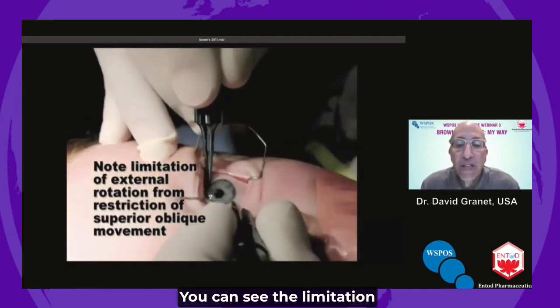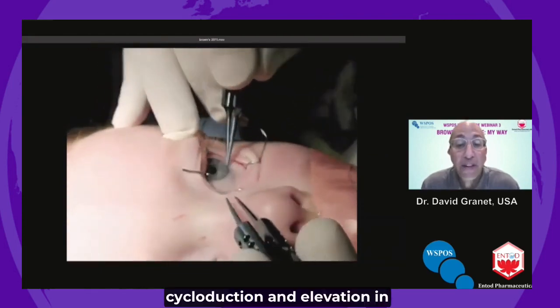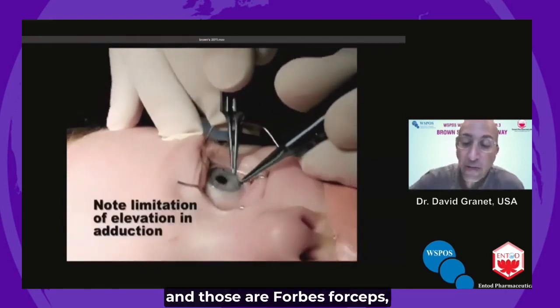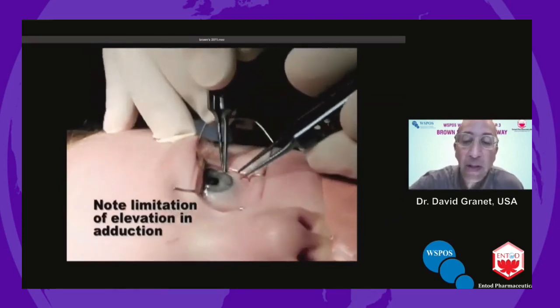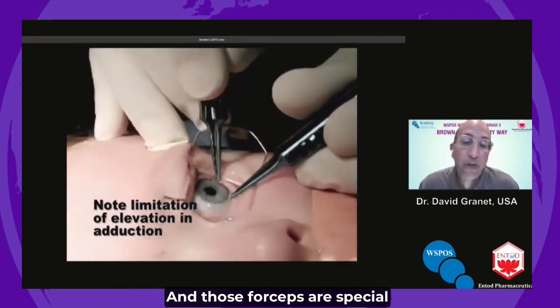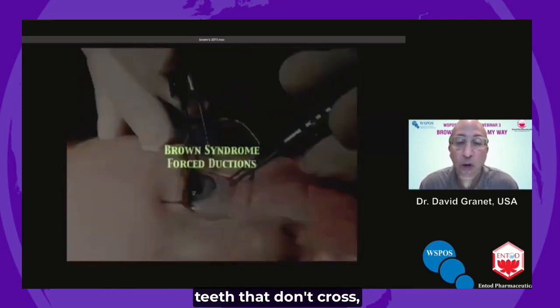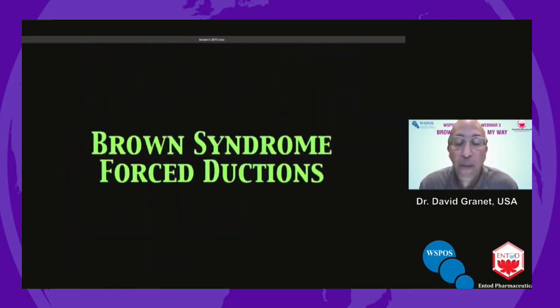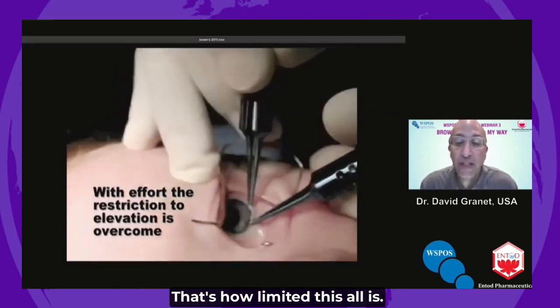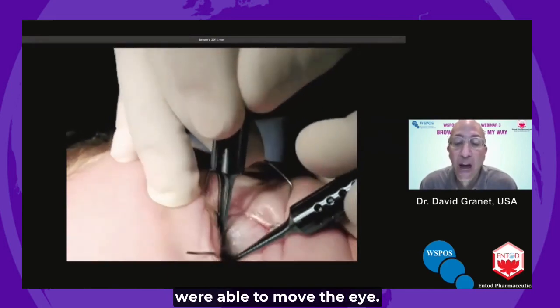You can see the limitation in cycloduction and elevation in adduction, even with two hands. Those are Thorps forceps — special forceps with a 3-2 configuration of teeth that don't cross, so they don't rip. I'm unable to elevate the eye in adduction, and you can see the whole head is moving — that's how limited this all is. But then it gave way and we were able to move the eye.